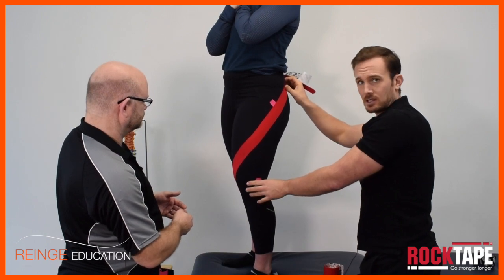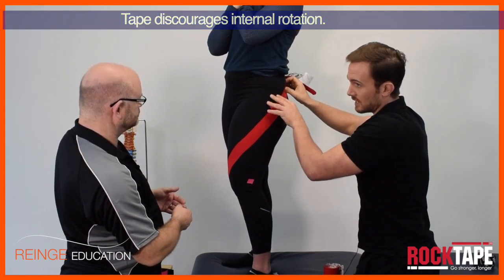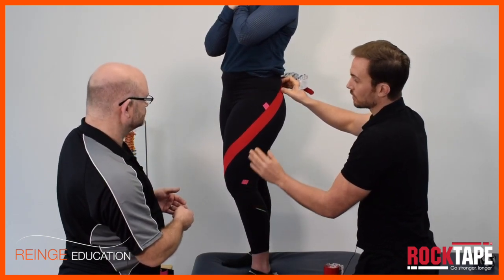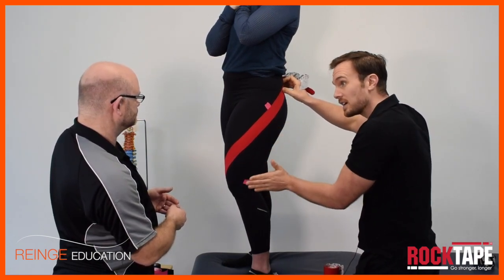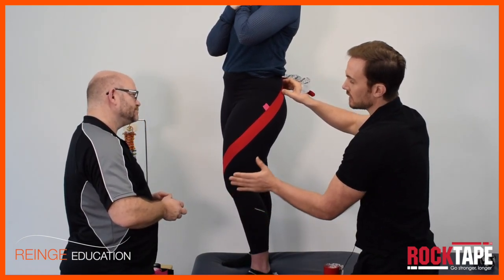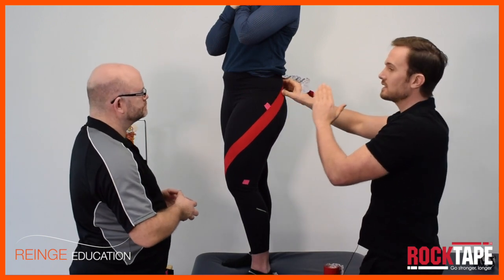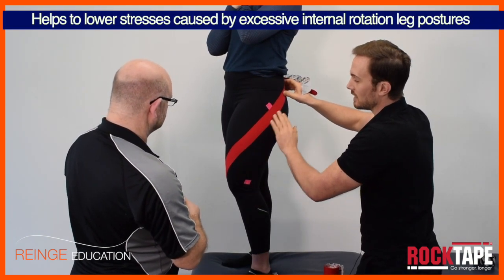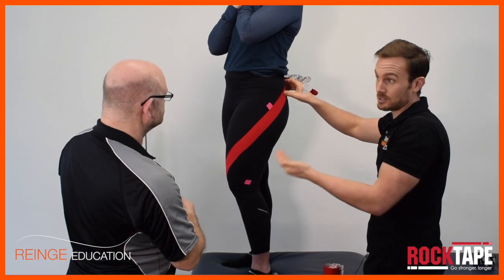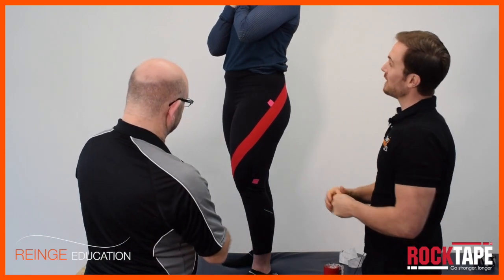The tension we've put on promotes external rotation but also discourages internal rotation. We know that lateral leg issues — such as lateral hip pain or lateral knee pain — can be linked to biomechanics where there's excess stress caused by excess internal rotation or combined with adduction of the leg. By reducing any unwanted internal rotation and unwanted adduction, we can biomechanically take the stress off these tissues. The tape provides information to help the patient achieve that during a rehab session and to have a longer-term outcome as well.